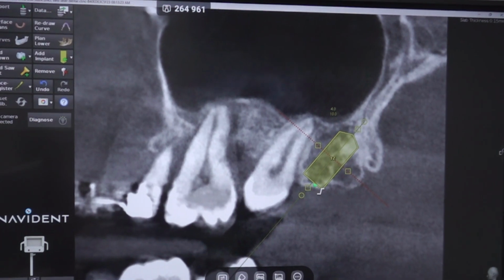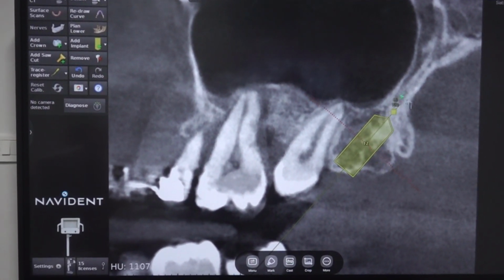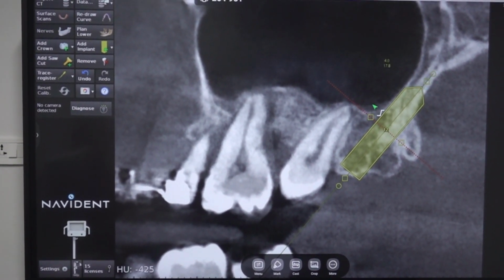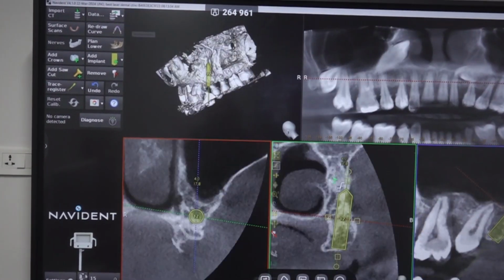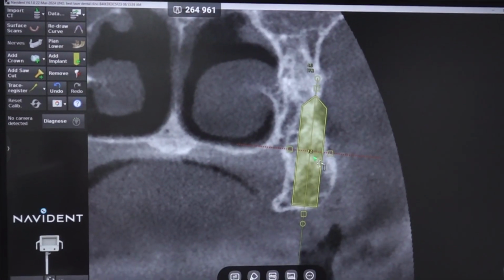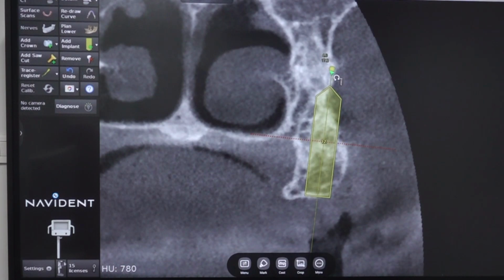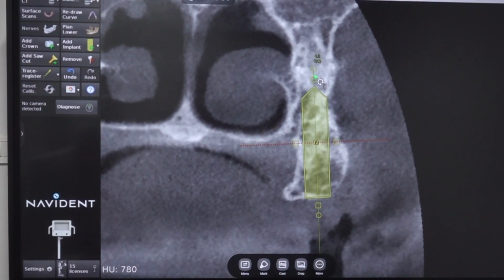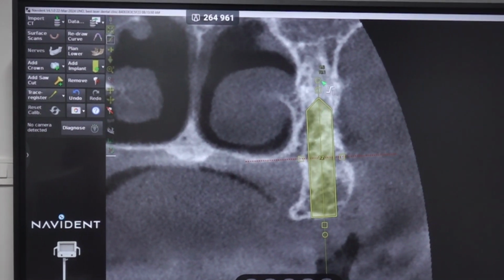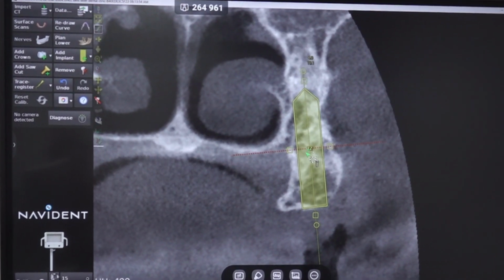If you start the drilling just behind the 8, almost like a 40 degree, we can raise this part. So this is the mesio-distal, this is the bucco-palatal. If you go like this, you will enter the mesio-distal. Ready? So slightly medially tilting. Okay, that is good bone.